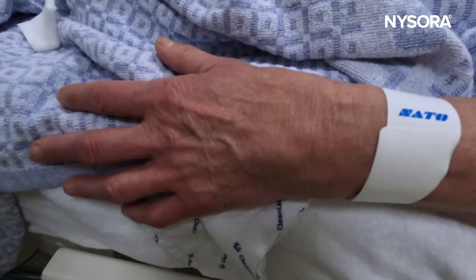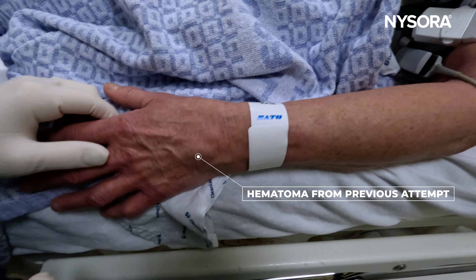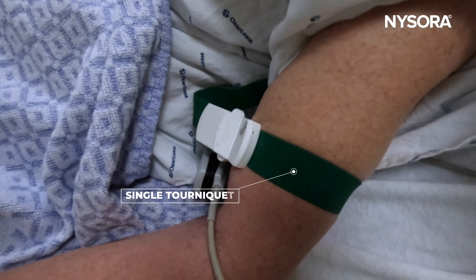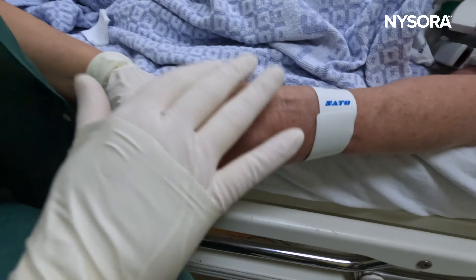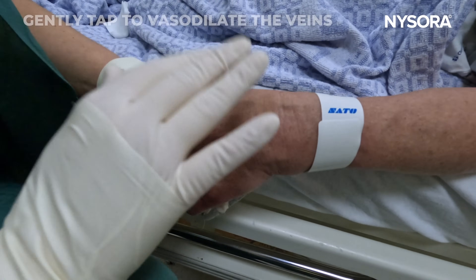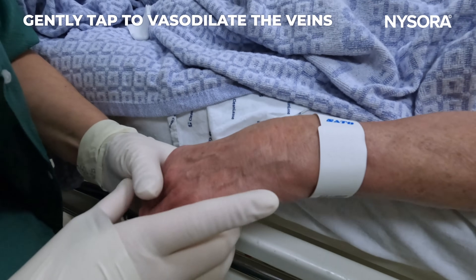It's a difficult IV — you can see a hematoma from a previous attempt. Here we have a tourniquet being applied. So let's see the technique of finding a proper vein and securing the IV access.